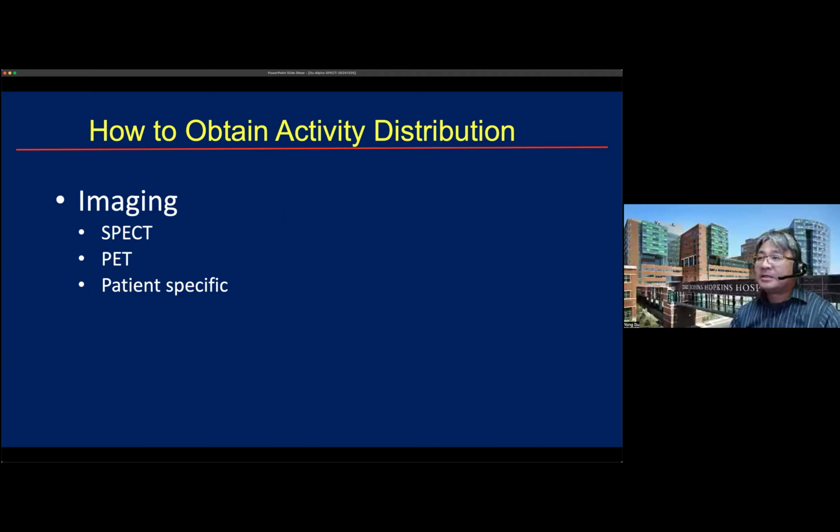So for radiopharmaceutical therapy dosimetry, SPECT is the most commonly used, because most therapeutic radionuclides also emit gamma rays or X-rays that can be directly imaged by SPECT. Then we can monitor the distributions as a function of time over a long period, and we can do this on specific patients to measure distribution specifically. So SPECT is ideal for radiopharmaceutical therapy dosimetry.